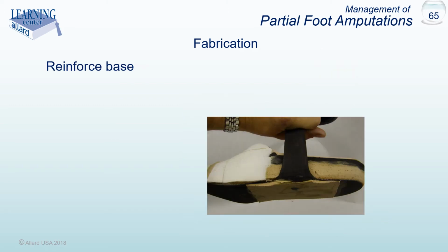In conditions of very high stress, it may be appropriate to reinforce the junction between the lateral strut and the footplate. Conform a high durometer material onto the plantar aspect of the footplate and taper that towards the heel and into the toe. This provides some bottom-up support for that junction.